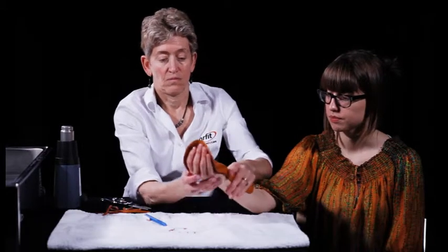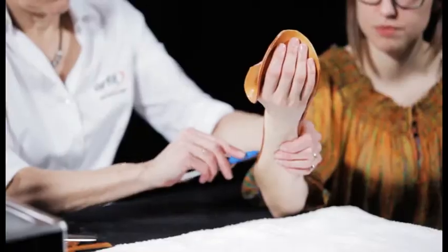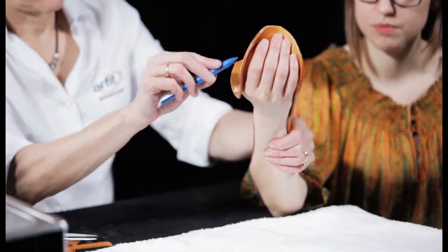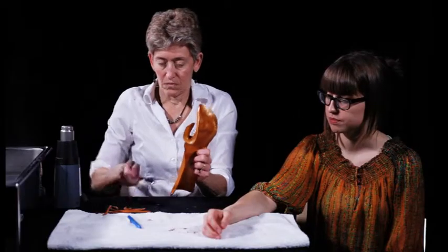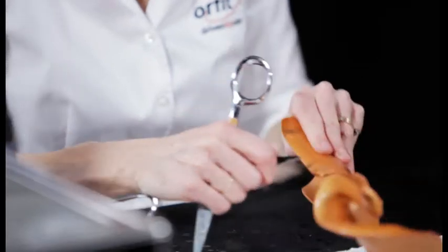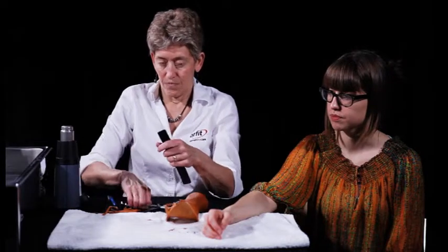Check the fit of the orthosis on the patient and note for correct positioning of the wrist and fingers. Mark the placement of the Velcro loop straps. Velcro loop straps can be attached directly to the thermoplastic material. Orfit Colors NS has a coating which must first be removed by scraping with scissors.